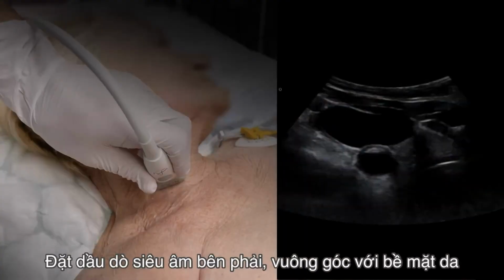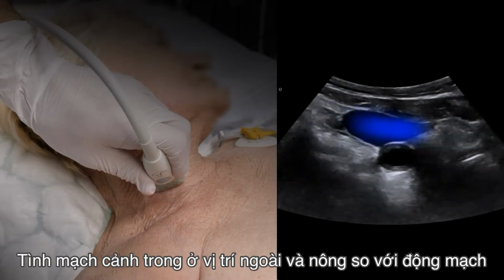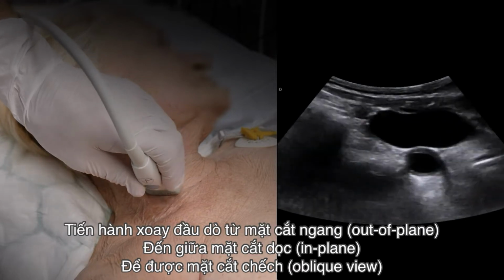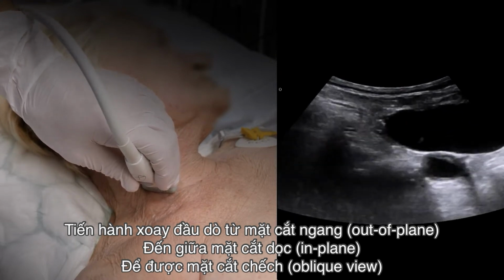Place the probe on the right side of the neck, perpendicular to the skin. The vein is usually located more lateral and more superficial to the artery. If there is any doubt, try compressing the vessel. Rotate the probe to a position halfway between the in-plane and the out-of-plane view. This is the oblique view.